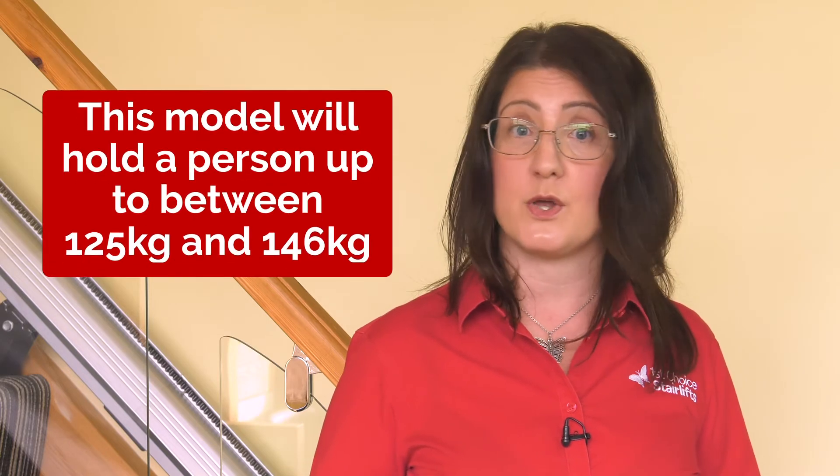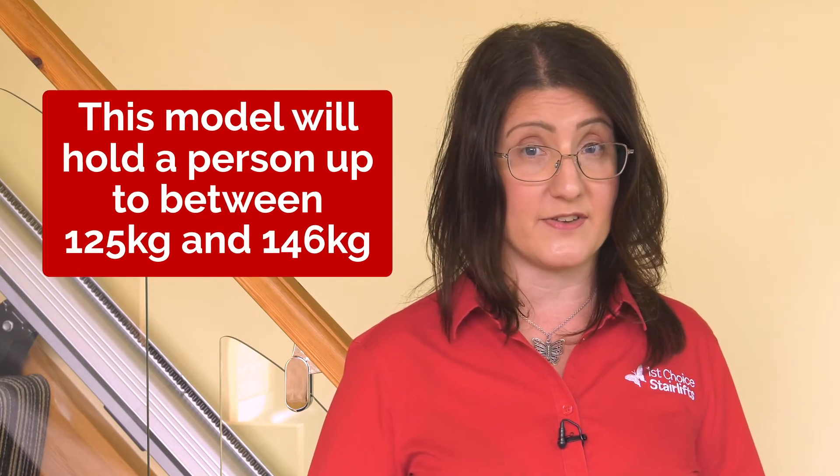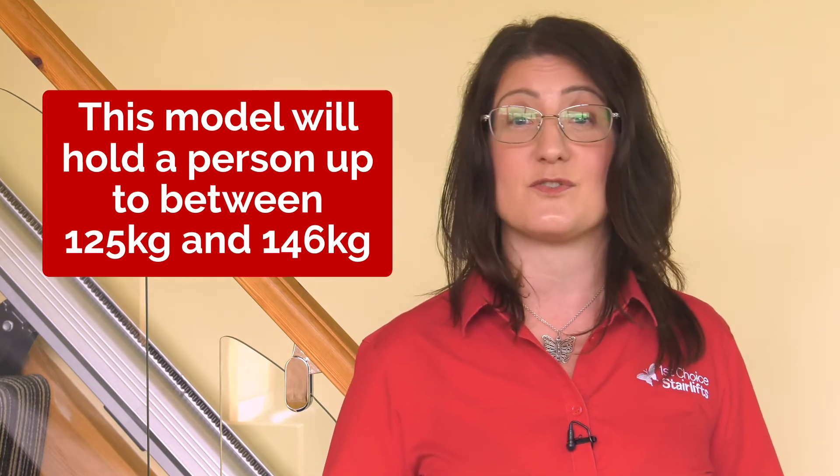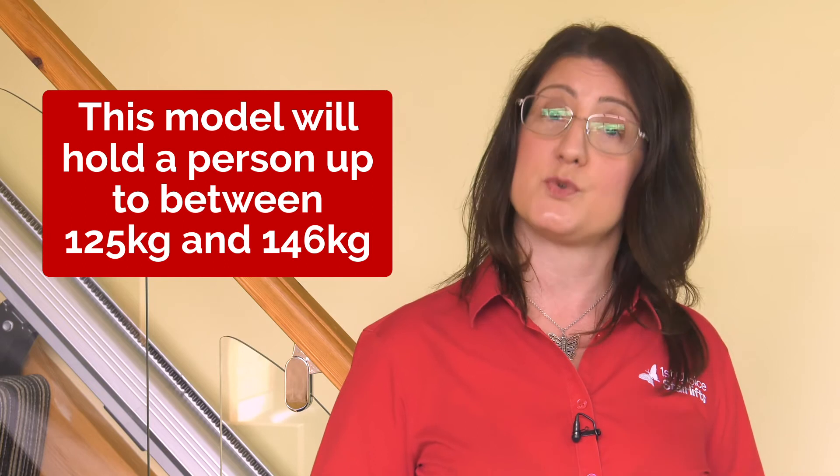Safety standards recommend your model be serviced and safety checked once a year, and we offer this as part of our aftercare service. All models have a safe weight limit and this model will hold a person up to between 125kg and 146kg — that's around 19.5 to 23 stone dependent on your stair angle. In summary, the Home Glide is a great high quality yet entry level model that can be fitted from stock in only a few hours.